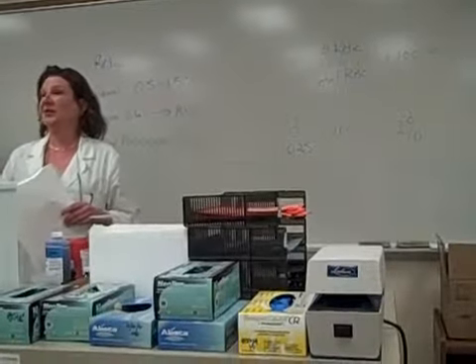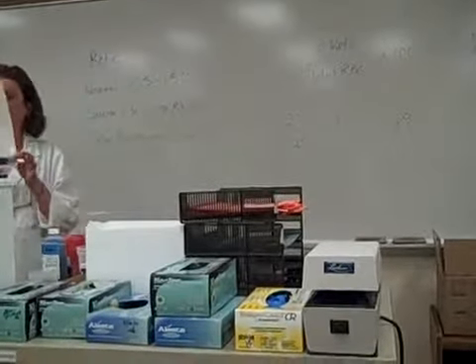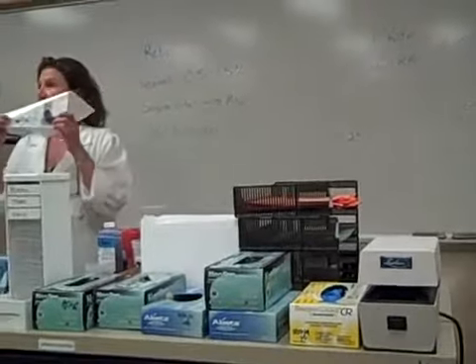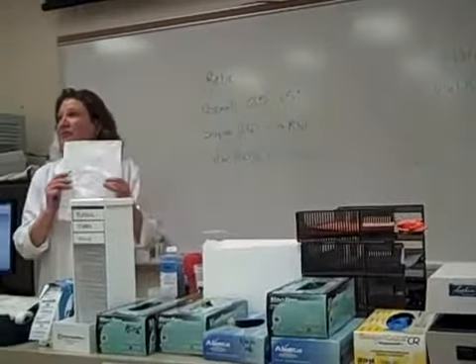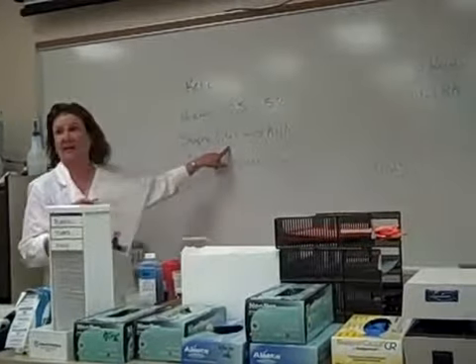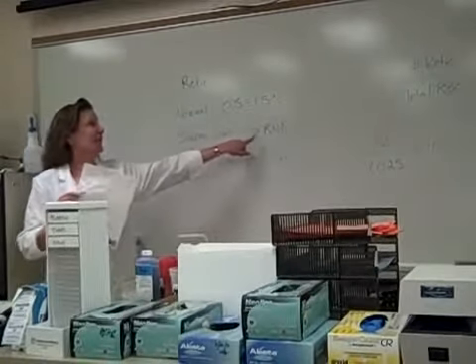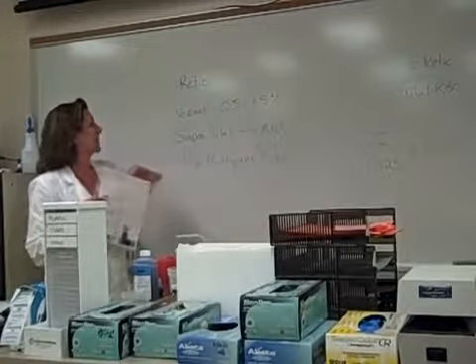Today in lab we're going to be looking at our retic stains. So instead of the purple slides, you're going to be looking at the blue-green slides, okay? That stain that we use to enumerate our retics is called a supravital stain. And it's going to specifically stain RNA. Okay, so that's what we're going to see.